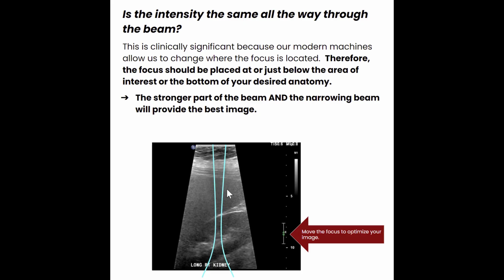So now if we're just looking at area, we've got less intensity here because of the larger area compared to the intensity with the narrow area at the focus. So again, attenuation-wise, more intensity, less intensity. Beam width-wise, less intensity, more intensity. Combining these two thoughts together then tells us that right above the focus ends up being the most intense part because we still aren't attenuating all the way through this area, but we are still experiencing a reduction in area.